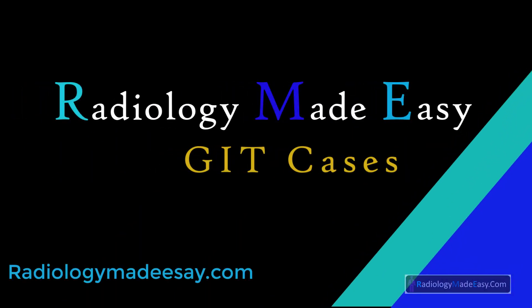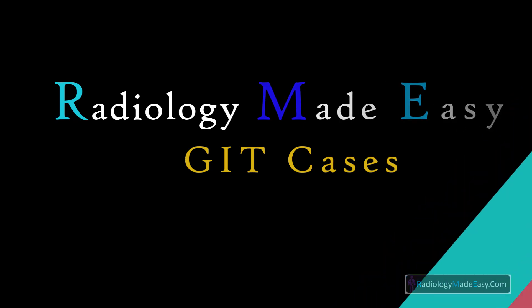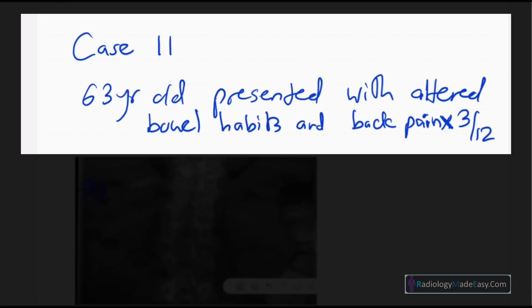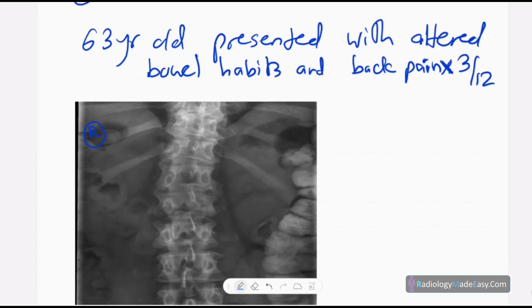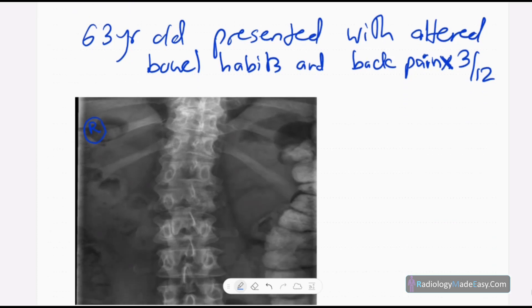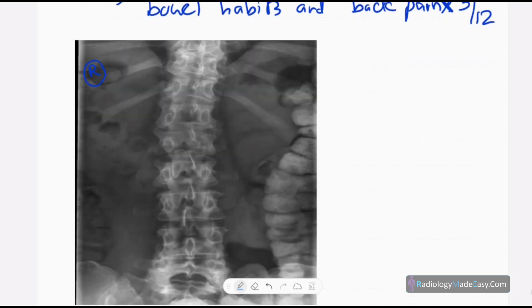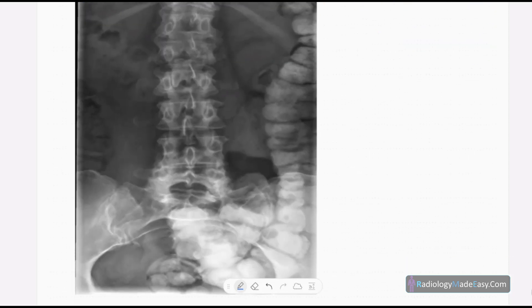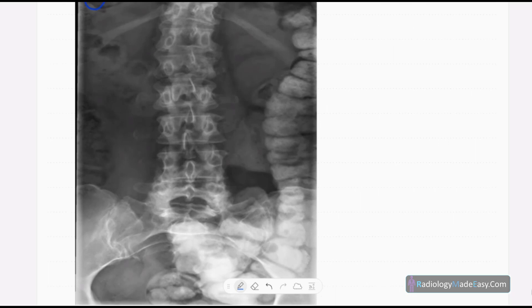Hello everyone, welcome back to Radiology Made Easy, your all-time favorite YouTube channel. This is case number 11 in abdominal radiology. Today our patient is a 63-year-old presenting with altered bowel habits and back pain for three months duration. This is the spot film taken in the barium enema study.